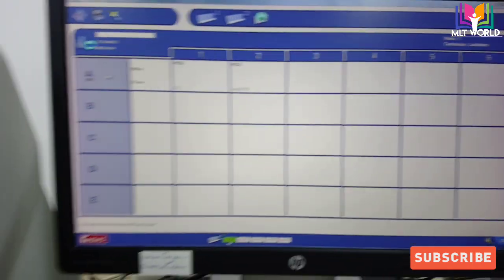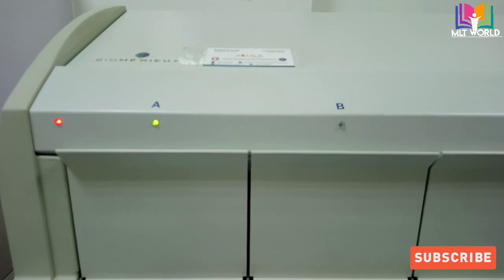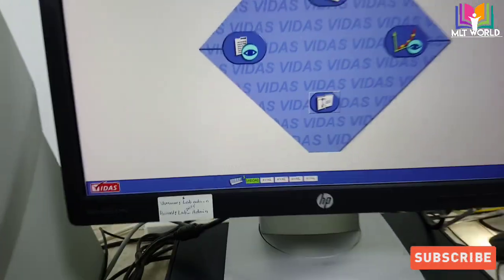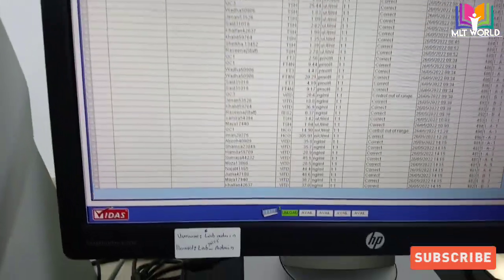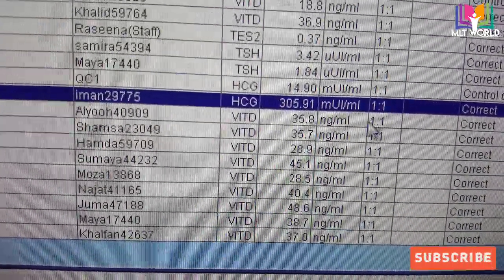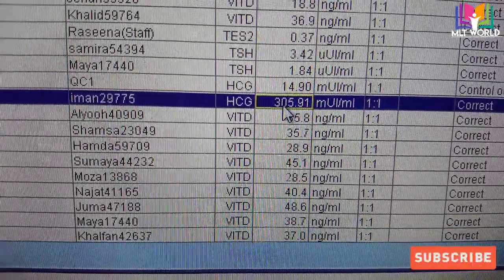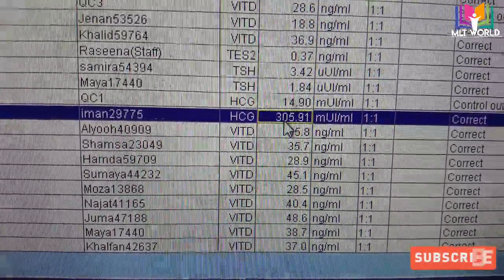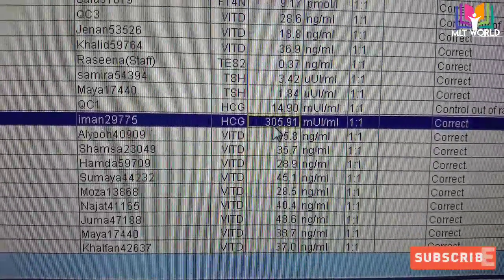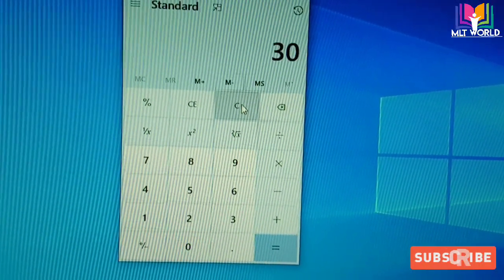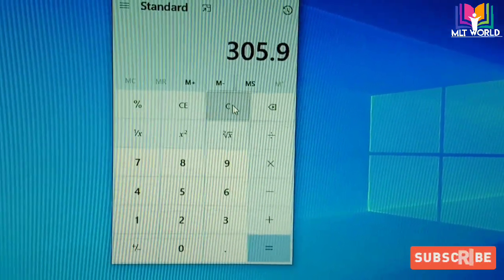With the HCG test we can know the number — the level of the hormone — and from that level we can get an idea of which week of pregnancy it is. The test depends on the patient's history and condition. The patient's HCG level came back as 305.91 mIU/mL. However, we will not report this value directly because we diluted the sample, so we must multiply by the dilution factor to get the final value.